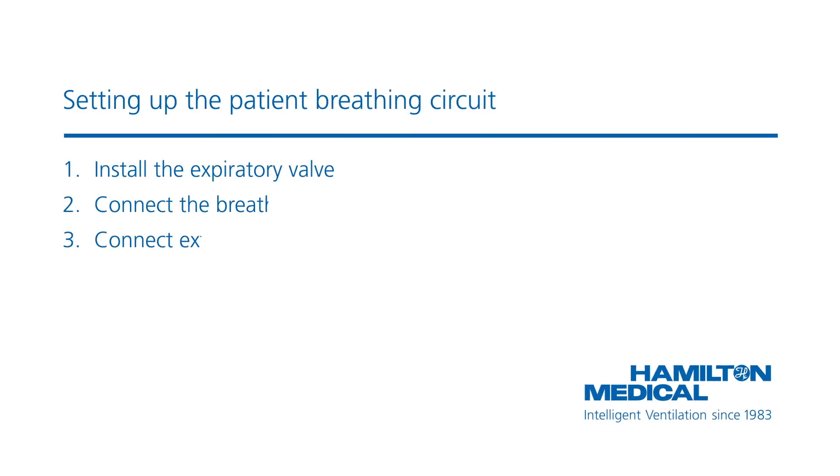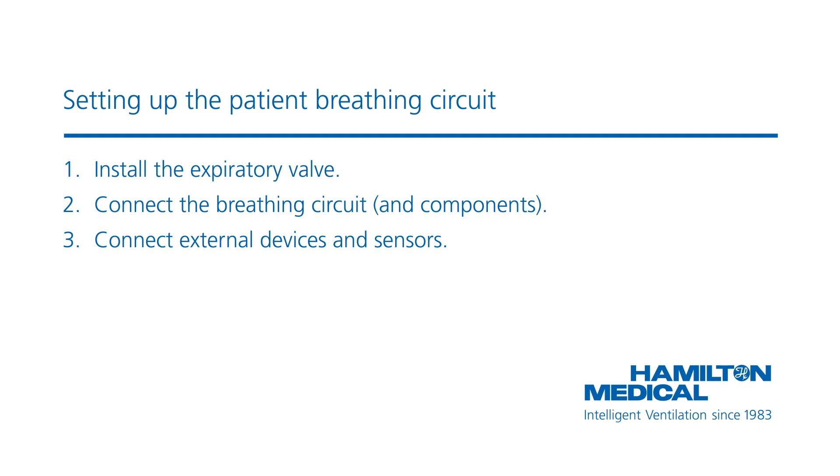To connect the breathing circuit, you need to firstly install the expiratory valve. Then you can connect the breathing circuit and components, and lastly the external devices and sensors. After this, you can perform any of the necessary tests, calibrations, and pre-operational checks.